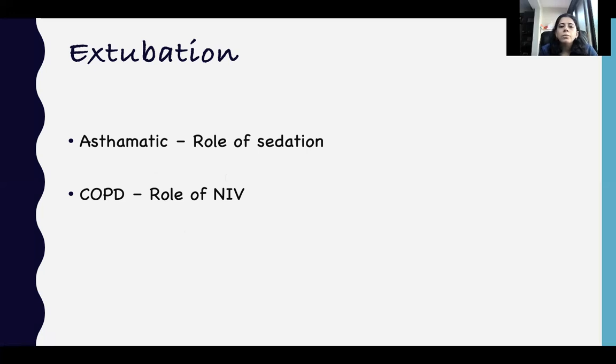This compromises their ability to generate adequate tidal volumes, with more muscle fatigue and a lot of muscle wasting. And this is the reason why they may require a prolonged pressure support. The easier way off is that when they are fully awake and have tolerated the pressure support mode, give them a short trial of 30 minutes and extubate them to NIV early, or they become difficult to wean and may land up on a tracheostomy.